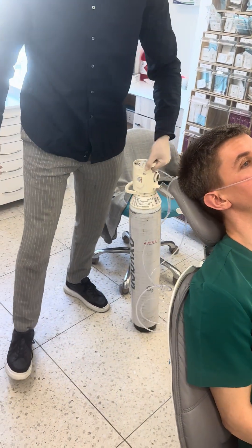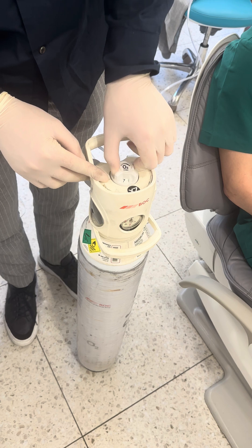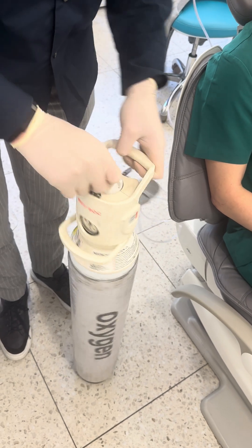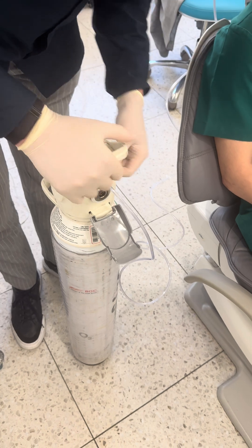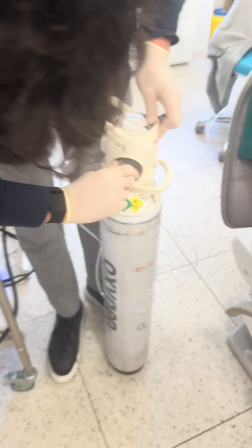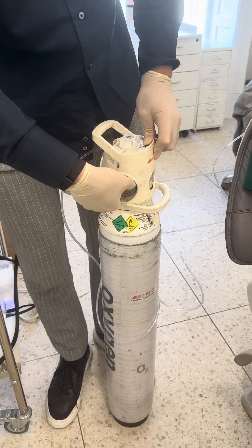When you're finished, you turn this off again — it's on, so this will go to zero. Then we close it and turn it off on the side again, all the way until you can't rotate it anymore.